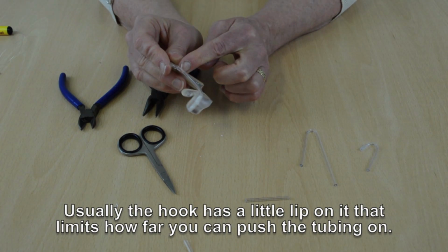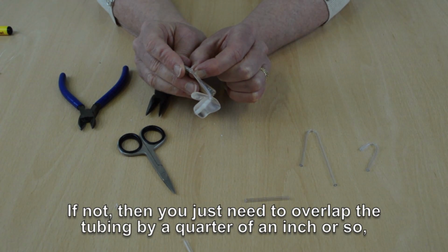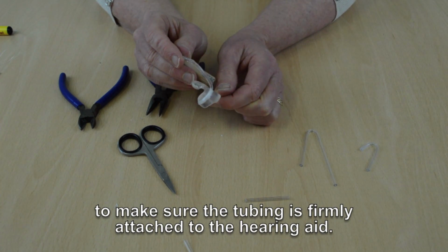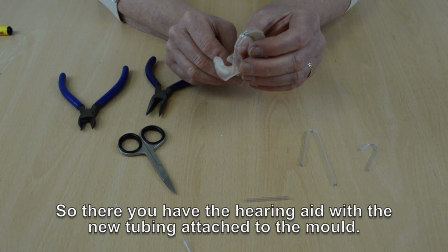Usually the hook has a little lip on it that limits how far you can push the tubing on, but if not, you just need to overlap the tubing by 1/4 of an inch or so to make sure the tubing's firmly attached to the hearing aid. And that will be the hearing aid with the new tubing attached to the mould.